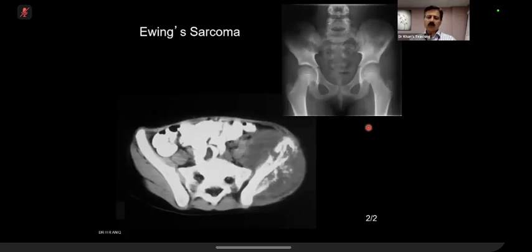If you read literature, literature will tell you that sometimes it's very difficult in Ewing's, or you can confuse an osseous matrix. You remember we were discussing osseous matrix in the previous chapter, and you can have a discussion in your mind, oh, is there osseous matrix?